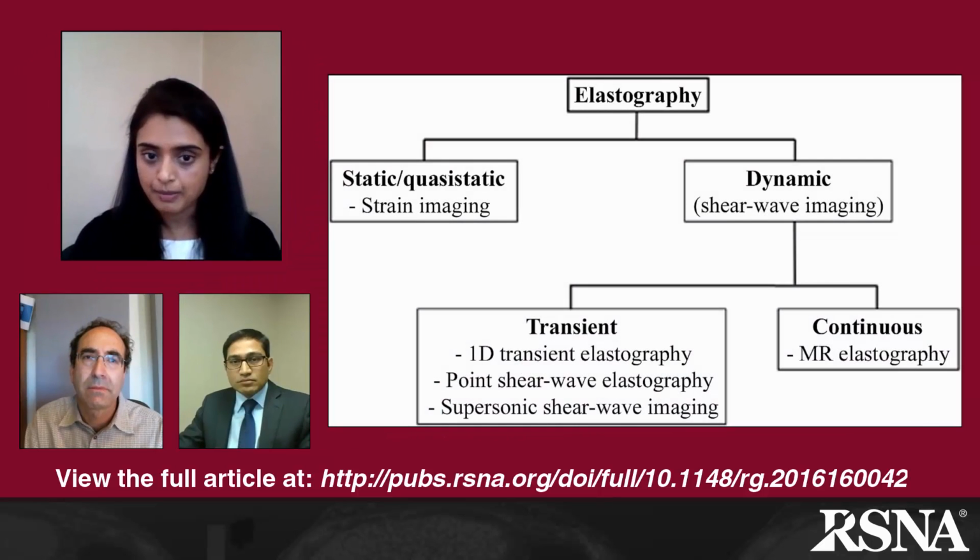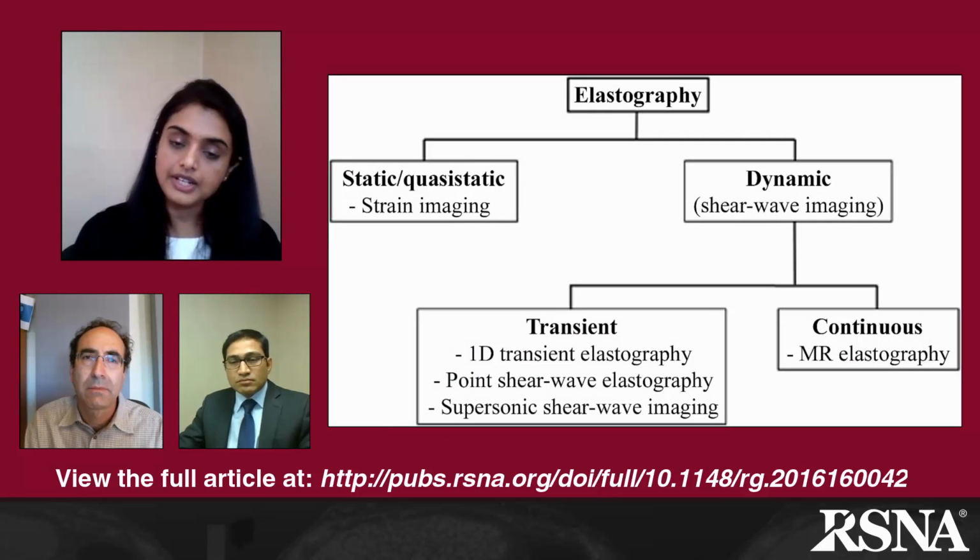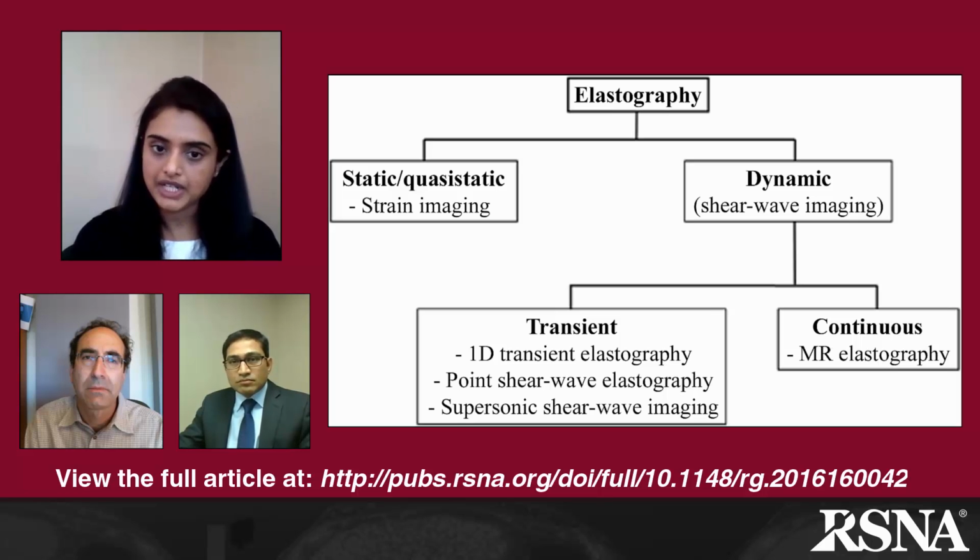The principle behind elastography is really quite simple. It relies on measurement of mechanical response of a tissue to outside forces applied on that tissue. In many ways, it can be considered a sophisticated palpation technique that was used from several centuries ago. It can be divided into two main categories, as we see from our Figure 2. And these techniques are either static or dynamic techniques.